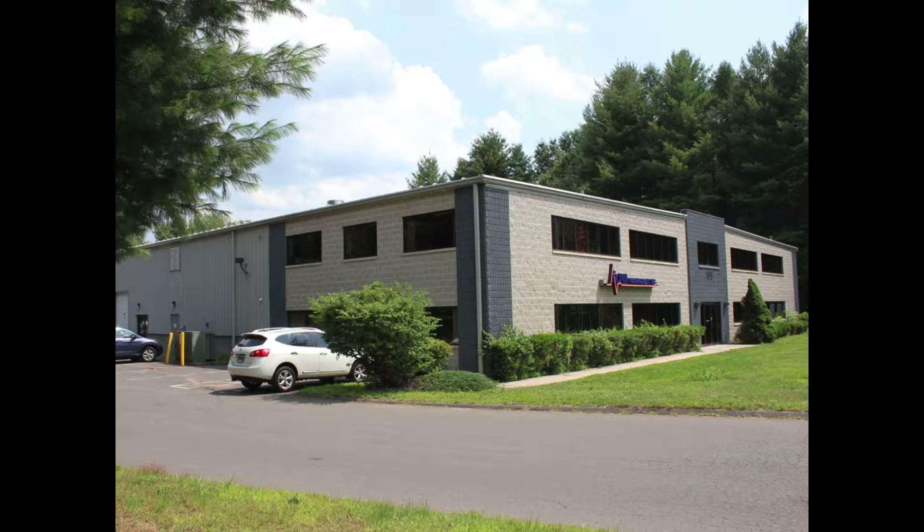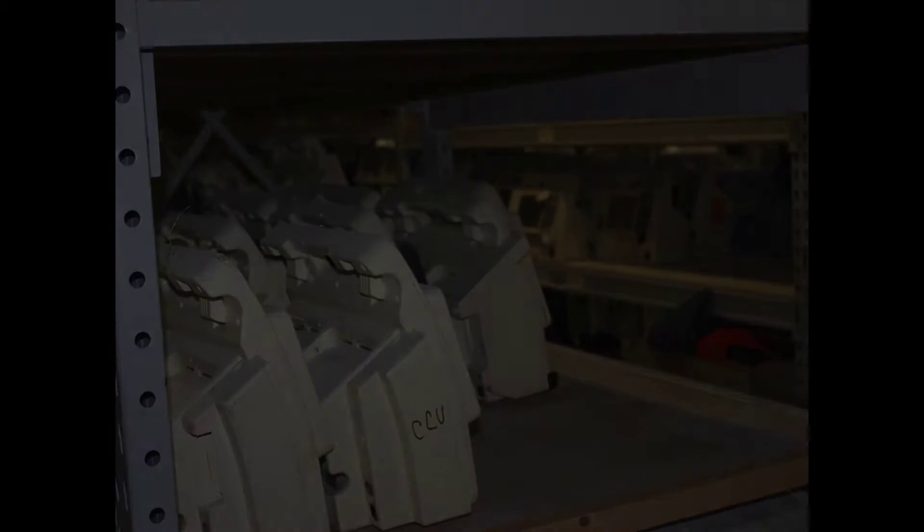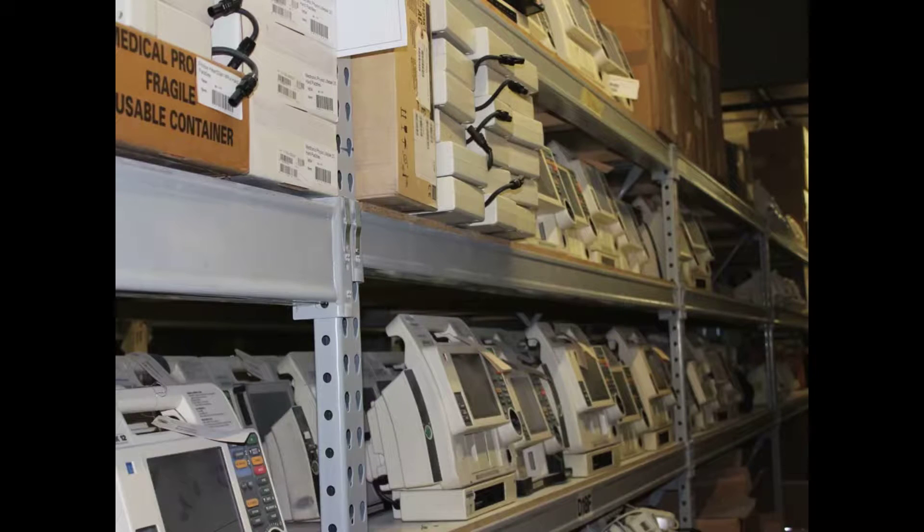We are a certified ISO 13485 facility in medical equipment. Incoming units have a condition inspection and are placed into storage. We have the largest in-stock inventory, with three warehouses located in the Northeast United States.